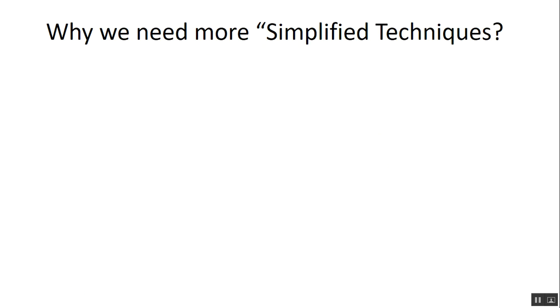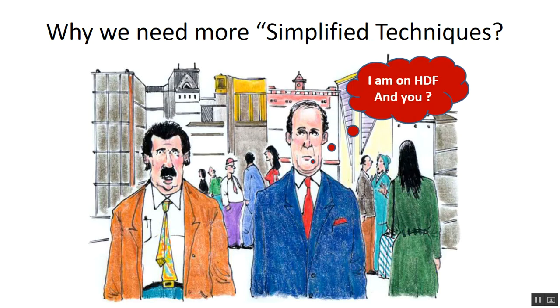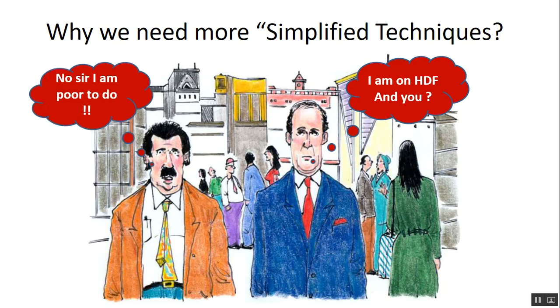احنا محتاجين ليه إن احنا يكون عندنا وسيلة علاج أخرى غير ال HDF وتساوي نفس الغرض؟ Simply لأن ال HDF is more expensive and complicated. Regular hemodialysis is cheaper a little bit, but still cannot be optimized as in HDF.